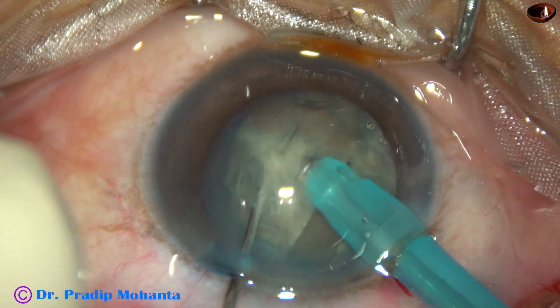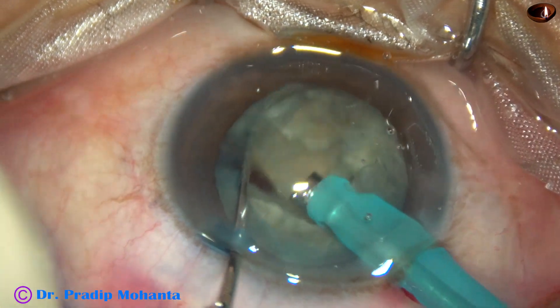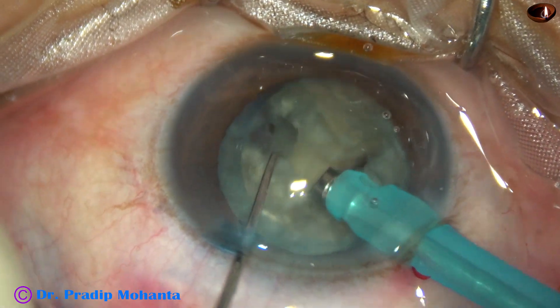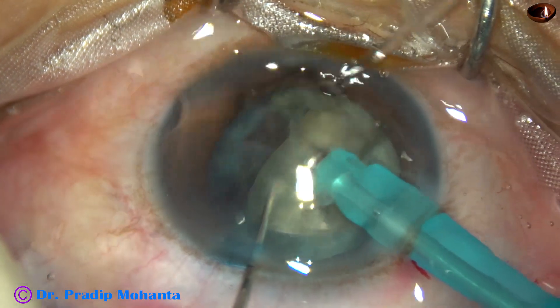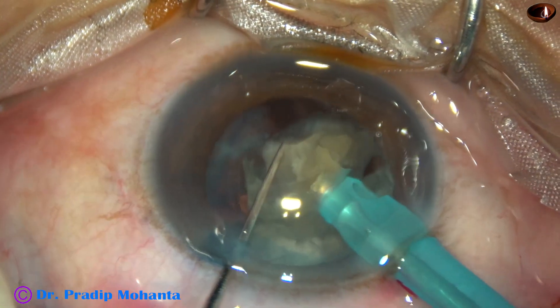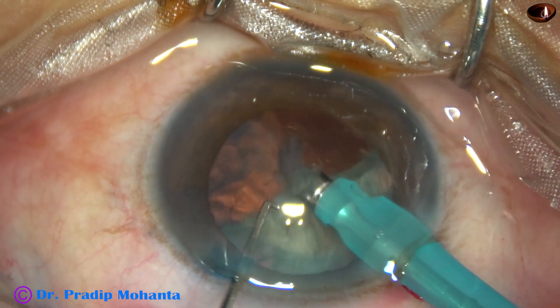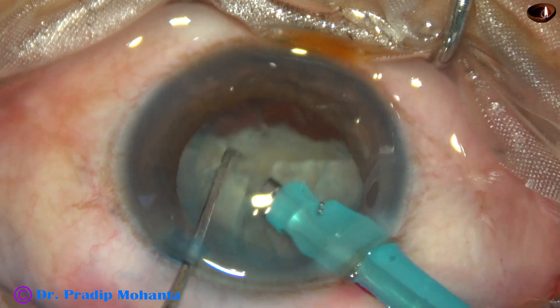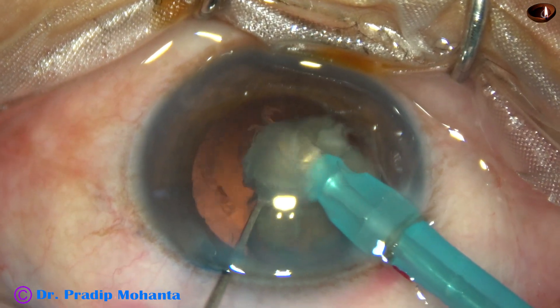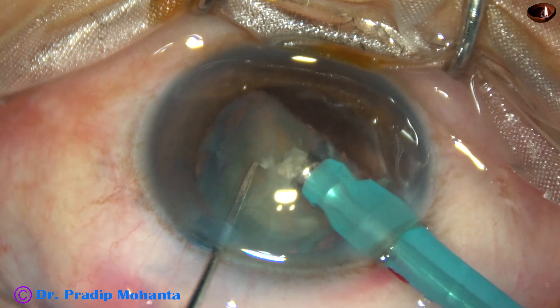Each heminucleus is chopped into two parts. The principle is to place the phaco needle at a deeper plane, hold the nucleus very firmly, and then chop it. Phaco power used in this case is 65%, flow rate is 45 ml per minute, vacuum is 400 mmHg. The machine being used is Oertli Cataract-3, with ultrasonic energy in continuous mode.